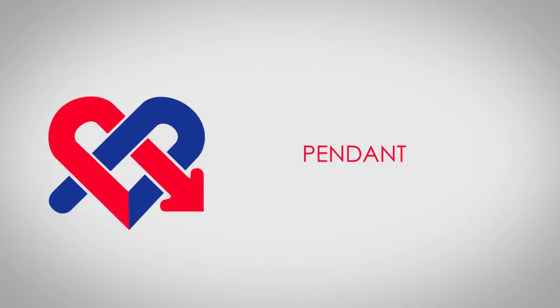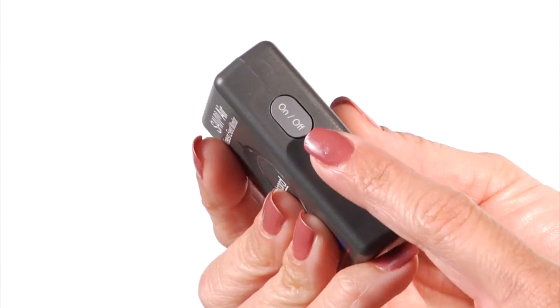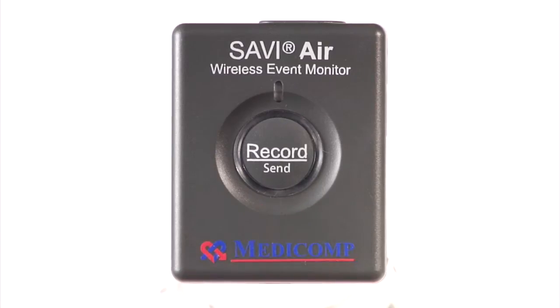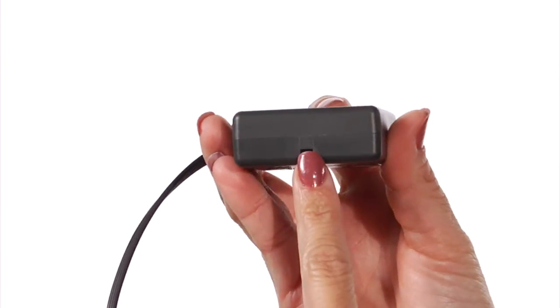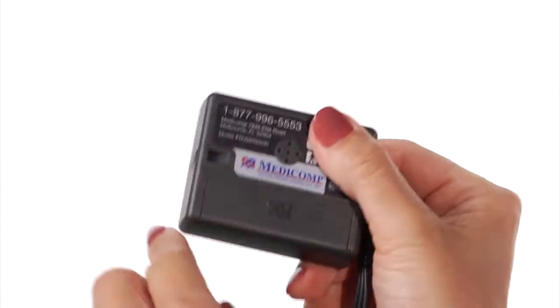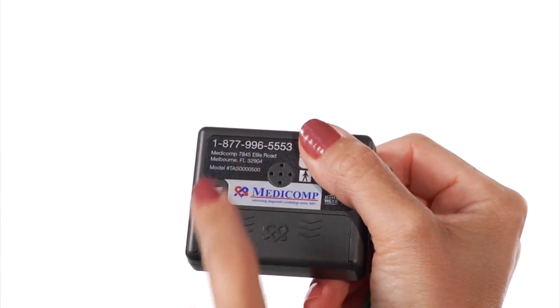Now let's become familiar with the Pendant. The Pendant has an on-off button, record send button, patient cable connector, and lanyard hook. On the back, you'll find the battery compartment and the toll-free number to the MediComp Cardiac Monitoring Center.